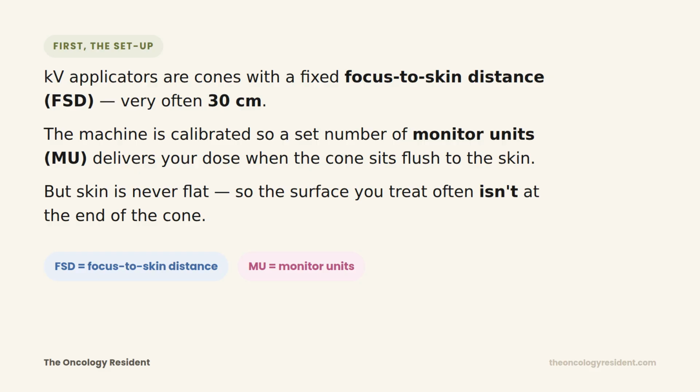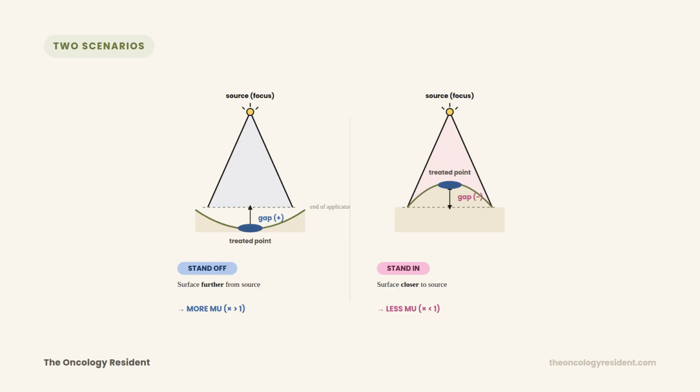The problem is, skin is almost never flat. Noses, ears, eyelids, scalps, post-op defects, they all curve. So the surface you're actually treating often isn't sitting neatly at the end of the cone. And that mismatch is exactly what standoff and stand-in describe. Here they are side by side.